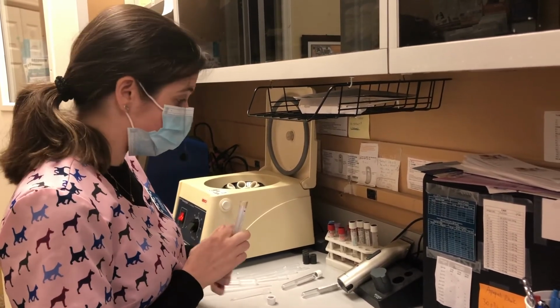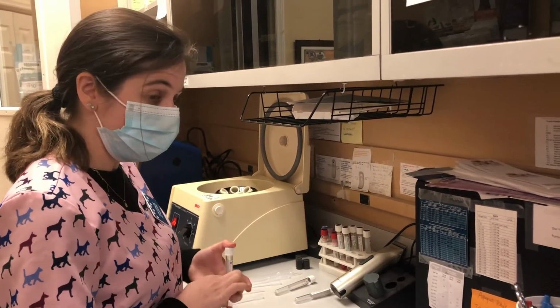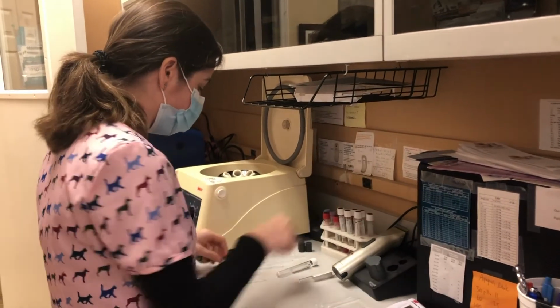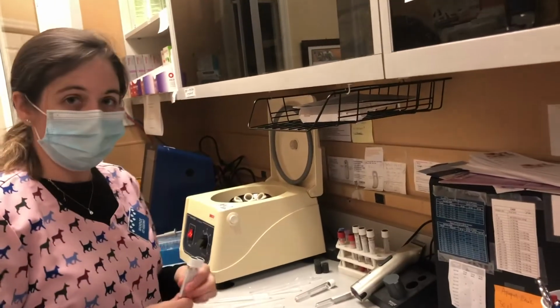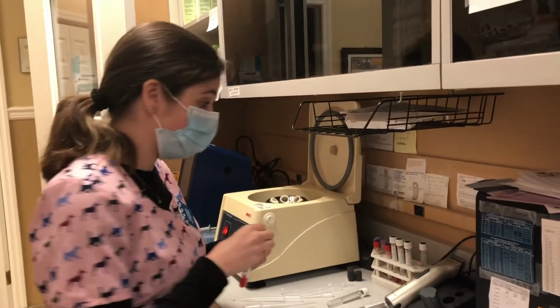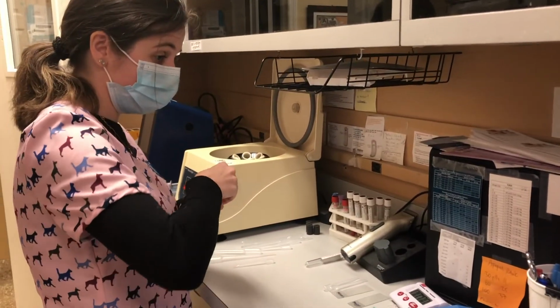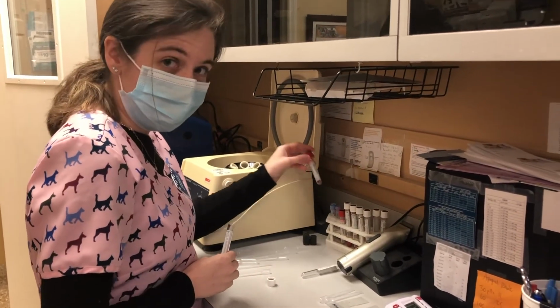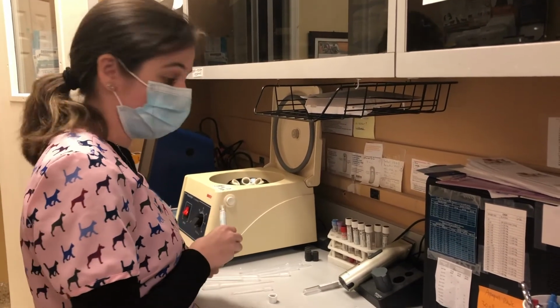And because we need something to compare our results to, I'm going to be making 2 controls, one for my recipient and one for my donor. So I've already gone ahead and made 2 cell suspensions for my donor and my recipient again. So what we're going to do this time is, I have my recipient tube here. I'm going to take 2 drops of my recipient serum and 2 drops of my recipient cell suspension and make my control that way.